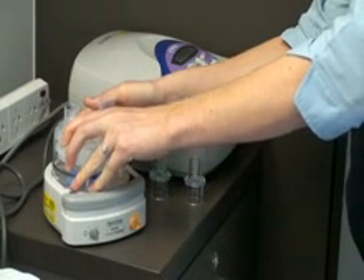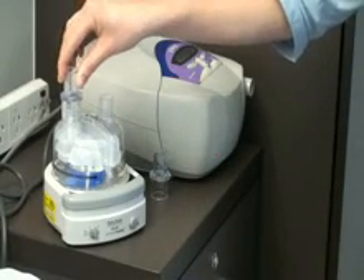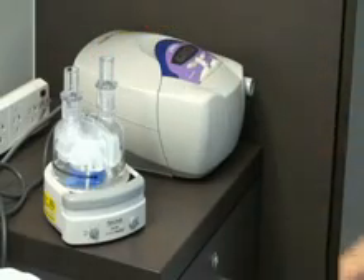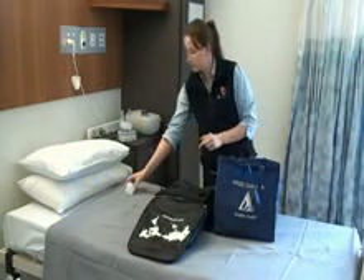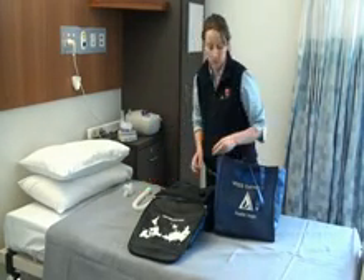Plug your humidifier base power lead into this power board as well. The humidifier has an on-off button on the front panel — ensure it is off. Attach the humidifier chamber to the humidifier base. Fit two 1522 plastic connectors to the ports on top of the chamber. Take a SureGuard filter, short breathing tube, and long breathing tube from your bag of supplies.